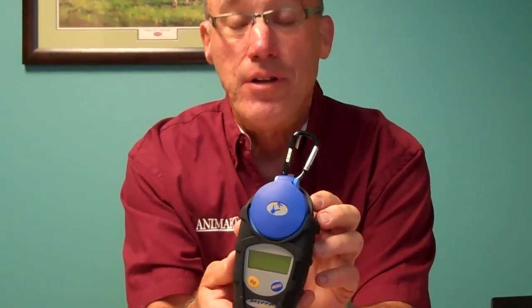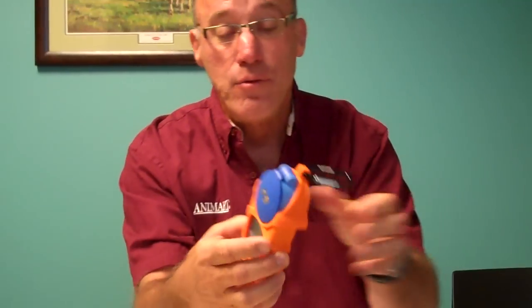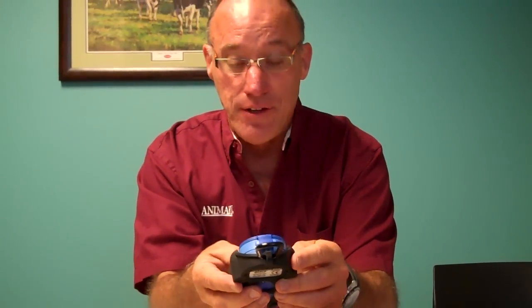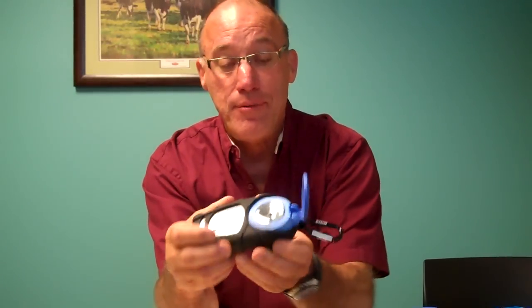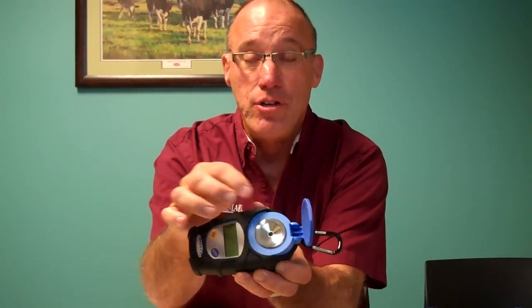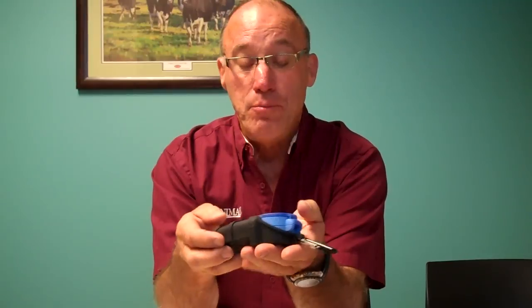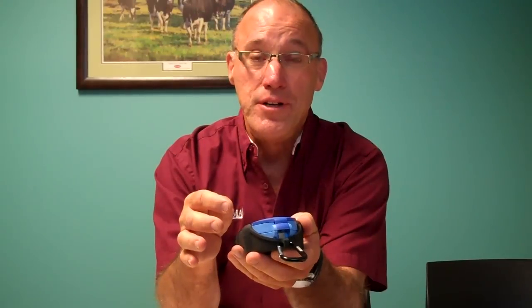The latest we have is these palm digital refractometers that can measure both colostrum quality in this one, and colostrum quality and total protein in this one. They're all digital so you don't have to read a scale — it'll just show up what it is. You just put a couple drops of colostrum on this little dot right here, close it, and read on what they call a Brix scale. 22 on the Brix scale is quality colostrum, with just a little bit of variance.